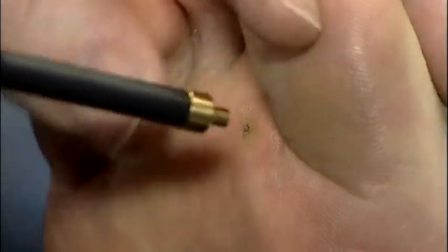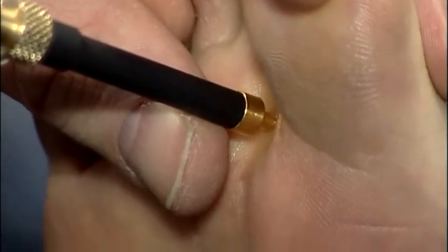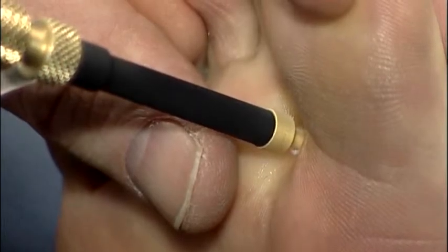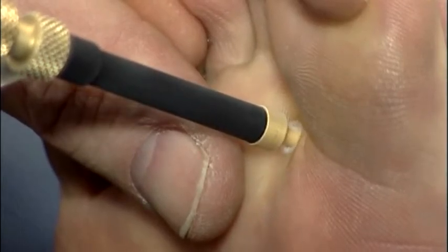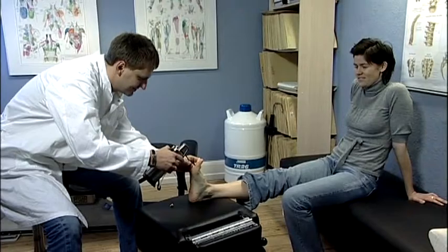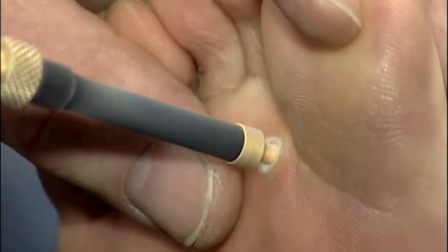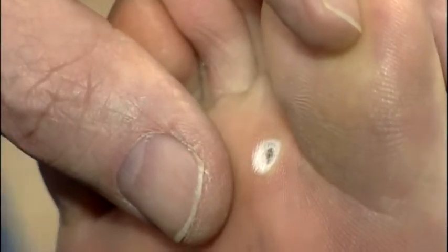Moisturize the treatment site with a drop of gel or a cotton bud soaked in water. Then apply the probe while it is still warm without pulling the trigger. With the probe in place, pull the trigger. After a few seconds, the probe adheres to the skin, ensuring optimal skin contact and heat transfer. Keep freezing until a 1 mm frozen halo is seen around the probe. Then release the trigger and the probe will come off in a few seconds. This method ensures the quick freeze, slow thaw, leading to optimal tissue destruction. Contact freezing offers a deep freeze with minimal lateral spreading.